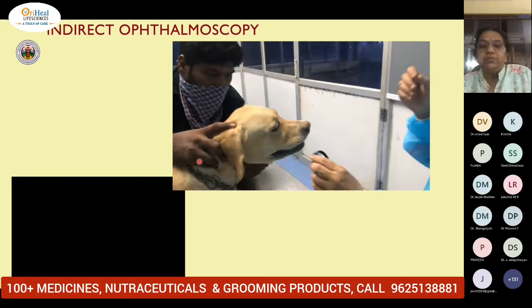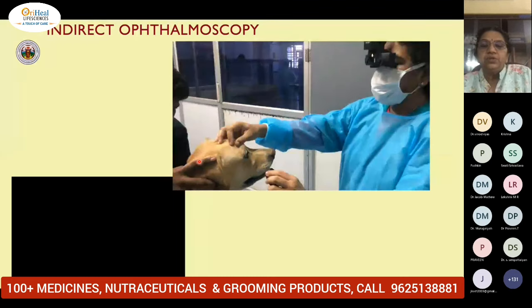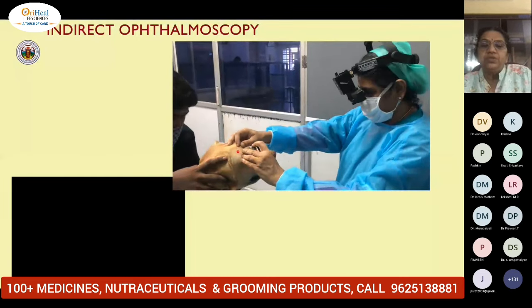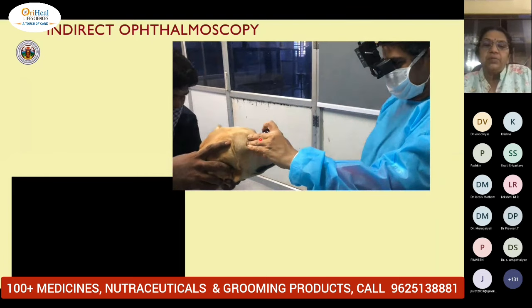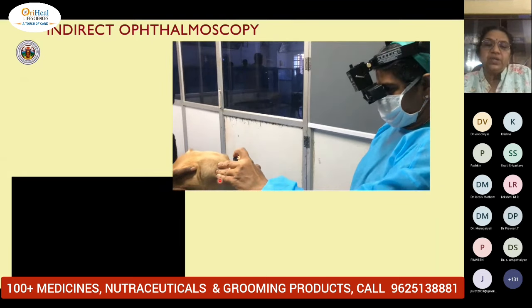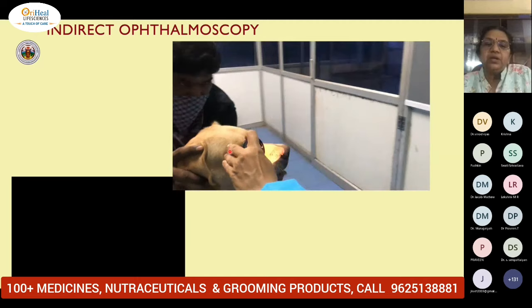So position the head of the patient straight towards you. What I used to tell the patient is the nose towards me. Okay, always I used to tell them. Now I am keeping my index finger fixed on the periorbital area.